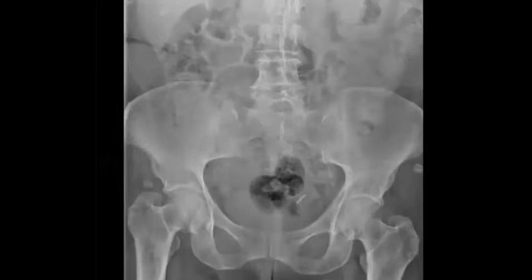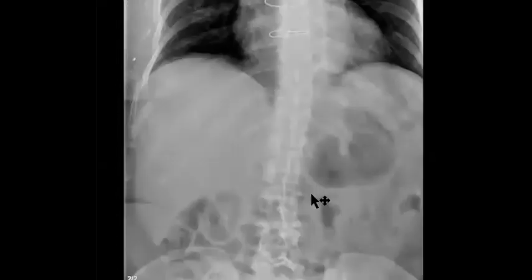In evaluating small bowel using radiograph, we have the patients come to the radiology department and we get a baseline radiograph. Then we have the patient drink contrast and we evaluate the proximal as well as the distal small bowel at various time intervals. So here we see the jejunum, and now we're starting to see the ileum. And we take this every 15-20 minutes until we see the contrast in the right colon as we see here.